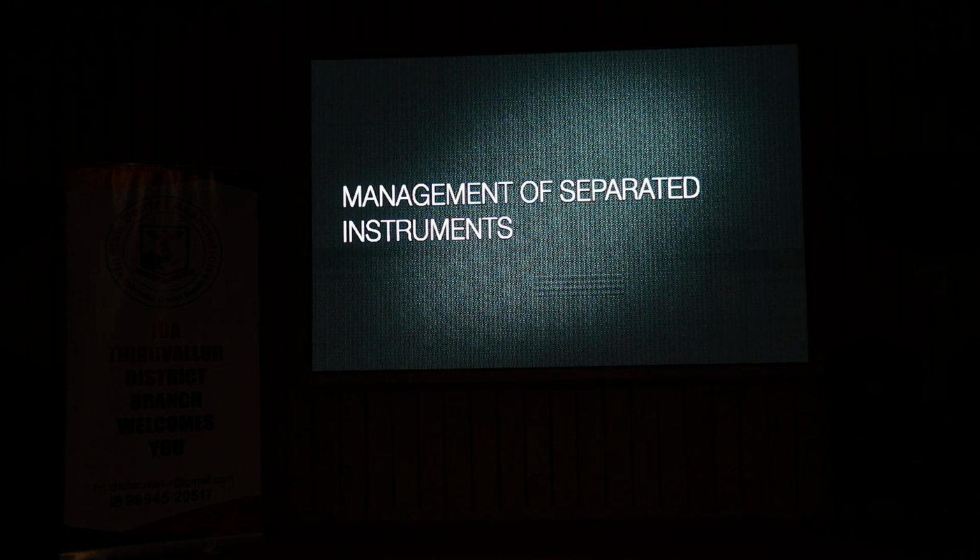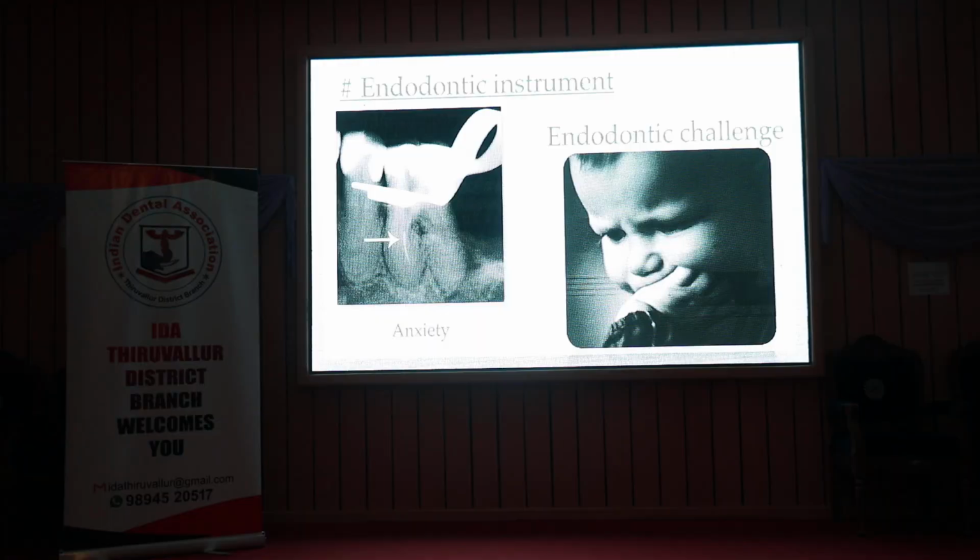That's it. Let me just go and address the last thing I wanted to, management of separated instruments. There are two things here. If you ask our postgraduates, ma'am will agree, the biggest thing a postgraduate fears is to come and tell me that there is a separated instrument. We'll come to what happens, because you know that it can compromise the outcome.